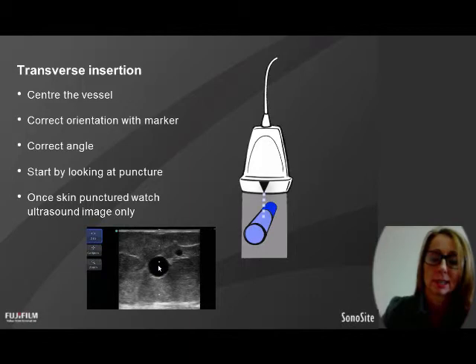So I really like that. It does take some skill and practice, and that's why the phantoms are fantastic. You can do 20 insertions in a minute if you want to, whereas on a patient, they're certainly not going to let you do 20 insertions. So use those phantoms, have lots and lots of practice before you go to a patient, and then start on the really straightforward ones that look like this one in the image here. Start on those.